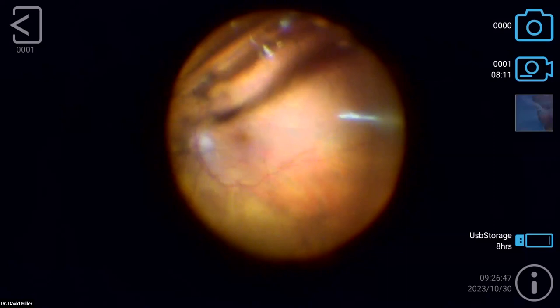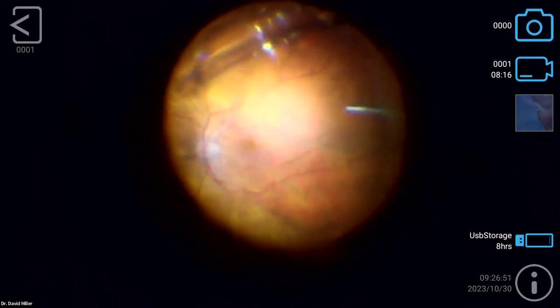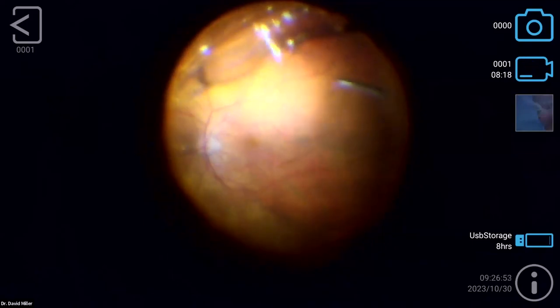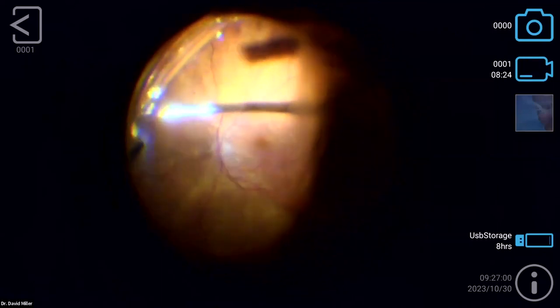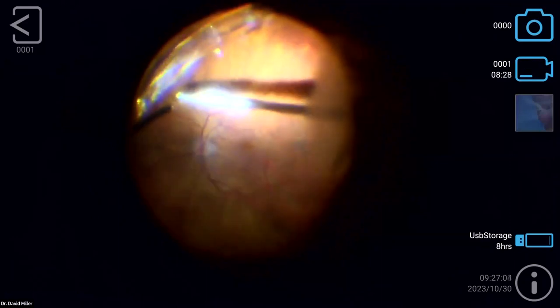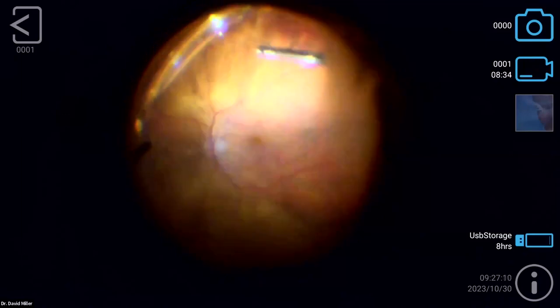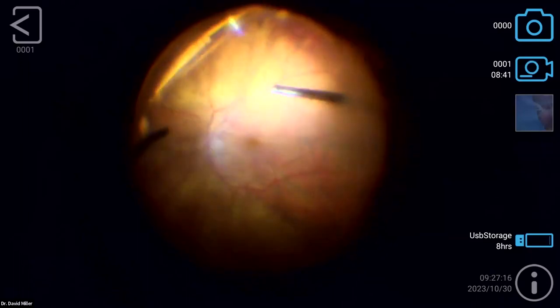And the peripheral retina, I do have the cutter pointed, I wouldn't say directly at the retina, but nor do I have it pointed at the middle of the eye. It's kind of sideways, just to engage some of that peripheral retinal skirt. These 25 gauge cutters do such a nice job of not pulling so hard to tear the retina, even when the port's faced towards the retina. The 20 gauge cutters, that was a much bigger risk, because they would grab more vitreous.